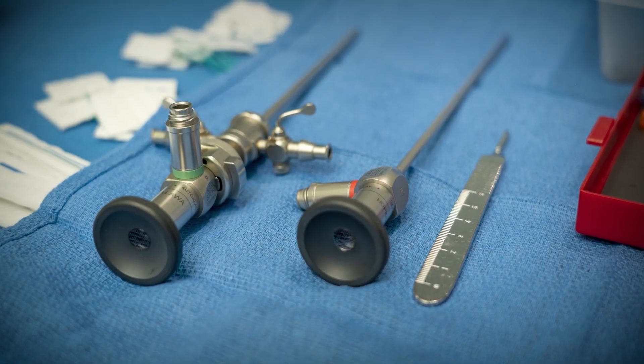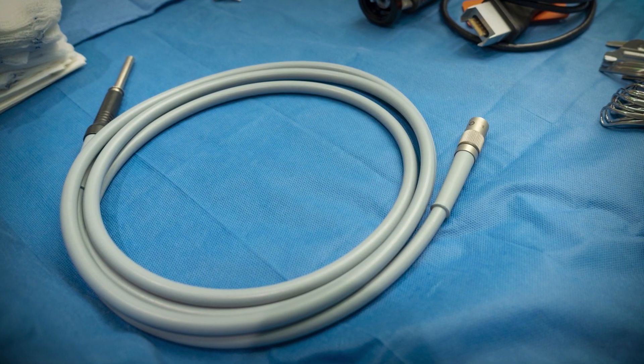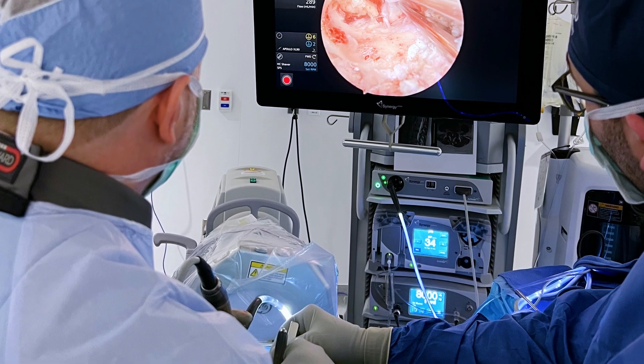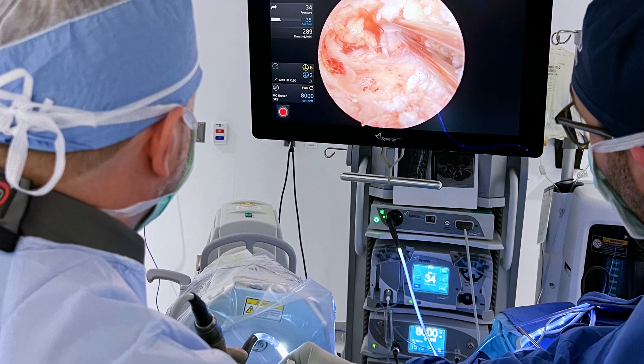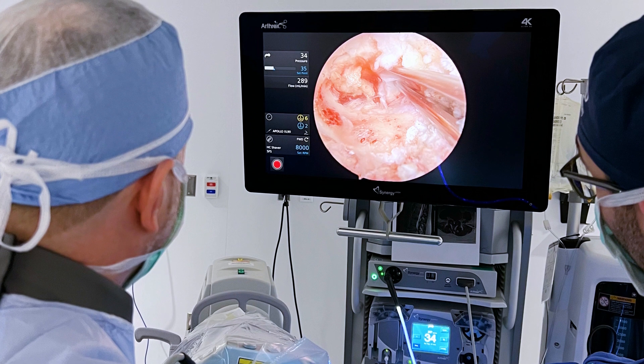These incisions serve as portals through which we insert specialized instruments and a high-definition camera. Using the camera, we can visualize the affected area on a monitor with great clarity, allowing us to precisely identify the problem and guide the surgical instruments accordingly.